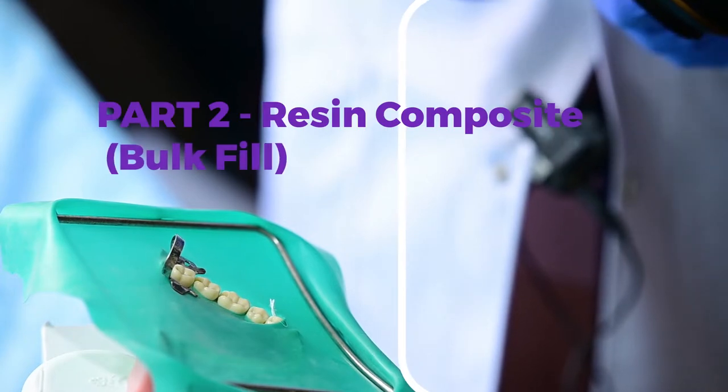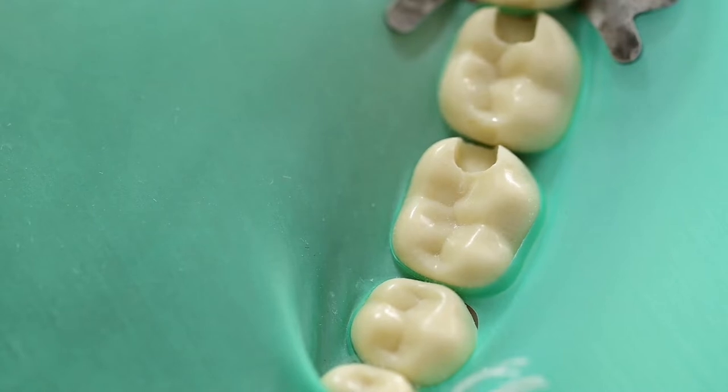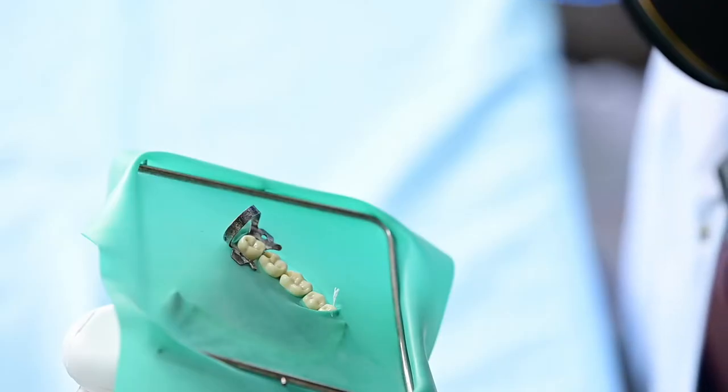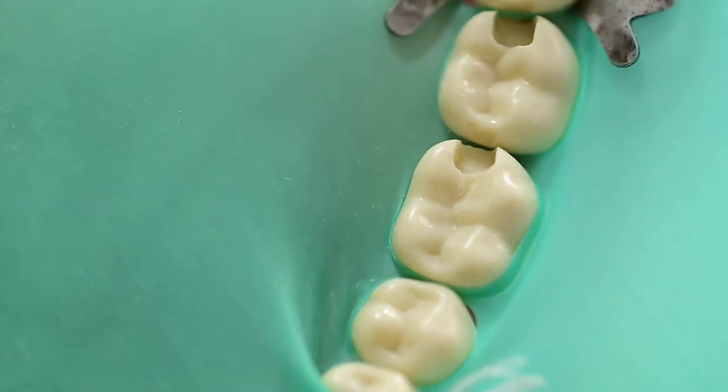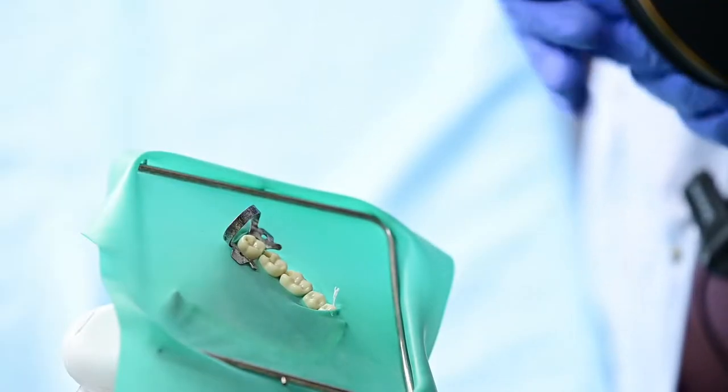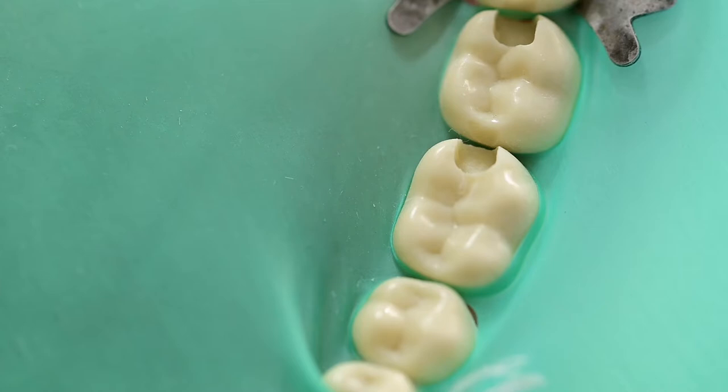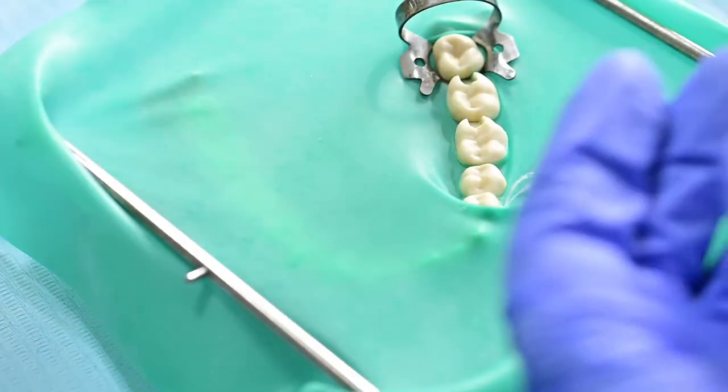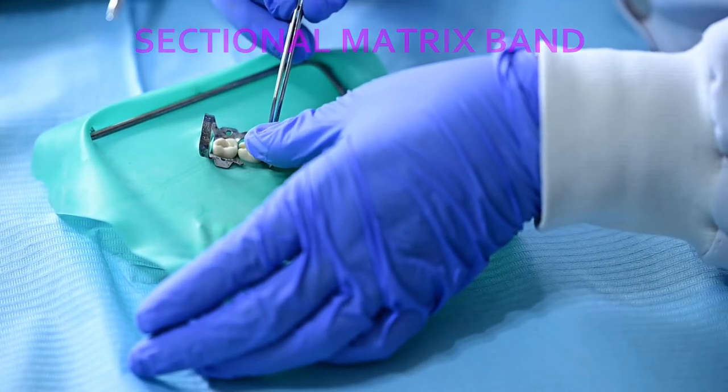I thought we can go through handling the material and filling up a proximal cavity box versus a class one. Just before we do the next step I would like to say that isolation also with cotton rolls and aspiration has been shown to create... The first step is to do pre-wedging. You are sure that you have separated the teeth by applying either a wooden wedge or you can use the elastic wedges that we talked about or even you can use the fender wedge. You select depending on the tooth size that you are dealing with and try as much as possible to place it.